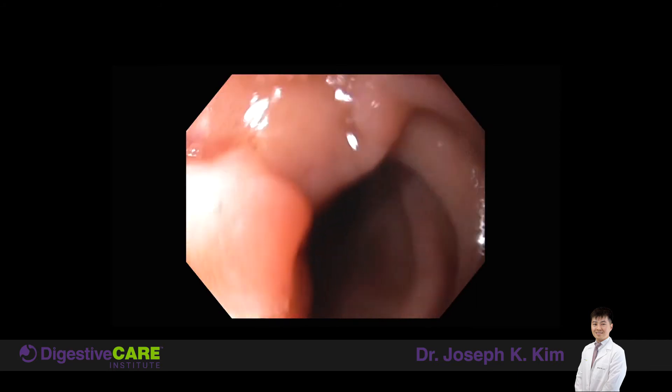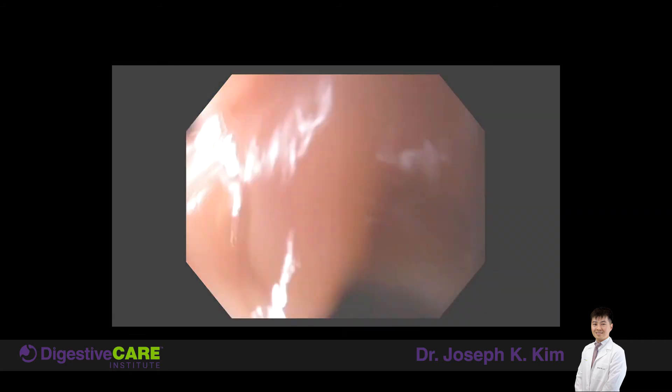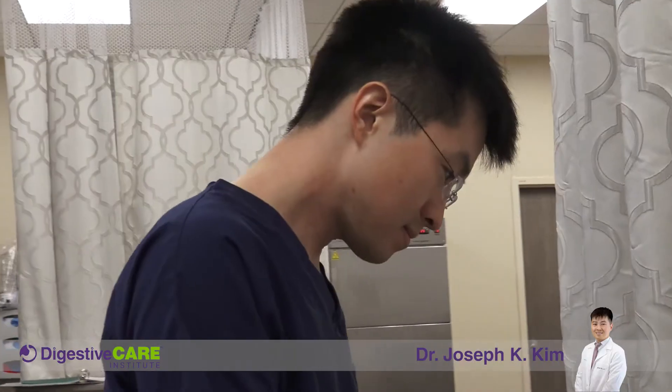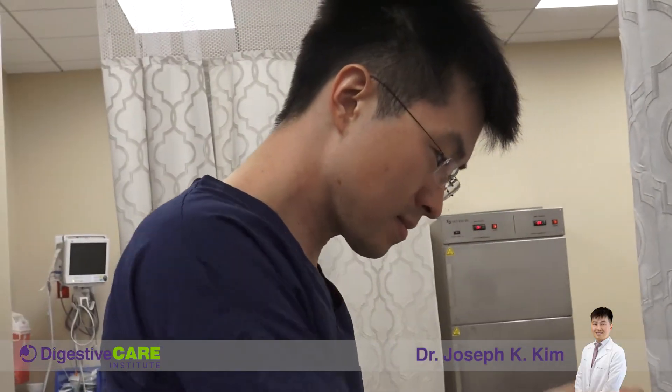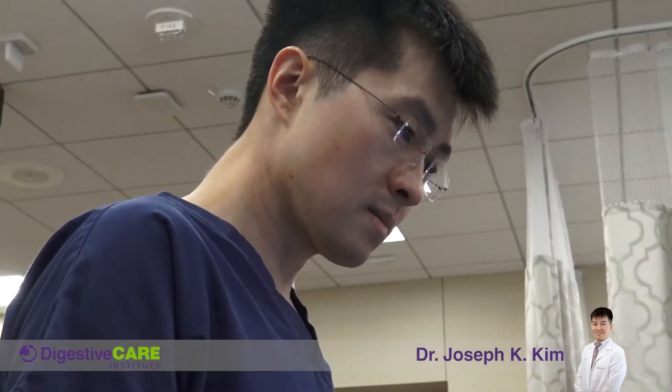That's how normally wide a small intestine should be. This patient did great post-procedurally. She required three to four more sessions of dilations, and she no longer had nausea, vomiting, or abdominal pain because the food was able to pass through just fine.